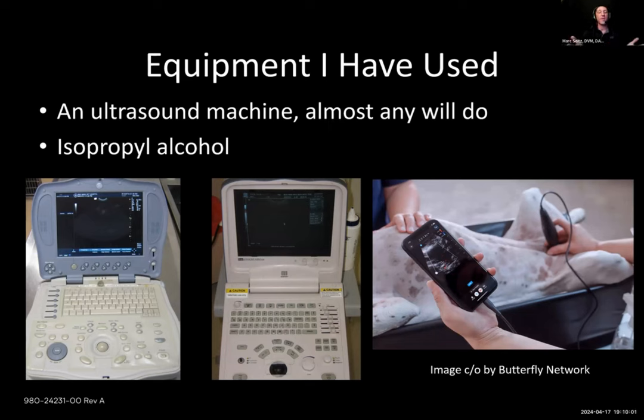But what you have in front of you are all machines that lasted 15 years, were used. And now Dave and I joke about it. If you had told me when I was graduating that I would be pulling an ultrasound out of my pocket in front of a client, I would have said, nope, you're teasing me. This is not real. Because this was back when cell phones were just taking off. I didn't get my first cell phone until midway through vet school. But we're at that point that for very economical pricing, you can bring ultrasound for the purposes of point of care, cystos, and it amazes me.